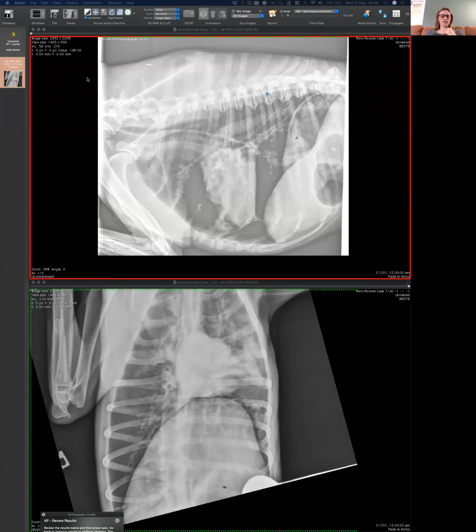Cool. And the other thing, clinically, we do see pneumothorax with severe pneumonia because of the loss of strength of the lung tissue. We're more prone to rupture, but not with acute onset pneumonia. So, time frame wise, it would make more sense to me if she'd aspirated during her dental and then coughed and ruptured a lung, and that's what caused the acute deterioration. But we just don't have radiographs demonstrating a pneumothorax to support the clinical pneumothorax. So it's a little bit of an unanswered question. I did a sneaky study in her, just because there was a little bit of a trace of a pneumothorax there. Could have been iatrogenic from the tap the previous day, but it certainly wasn't redeveloping in any significant volume, and she just improved really as you'd expect of a dog with aspiration pneumonia. Cool. Thank you. No worries.